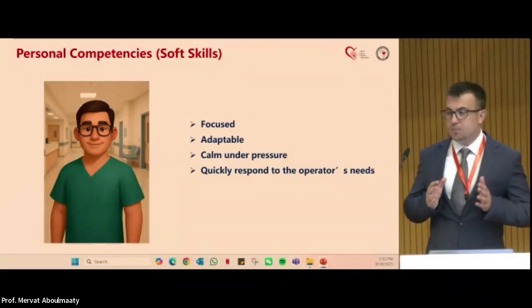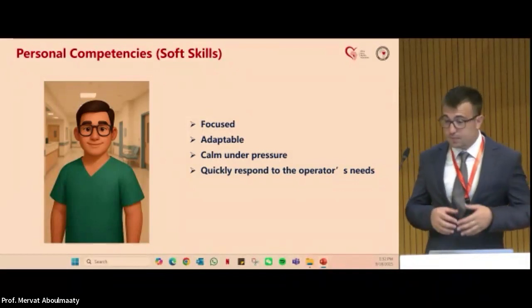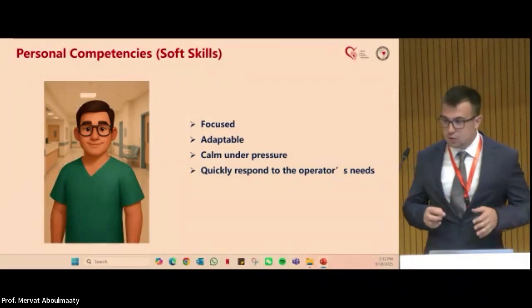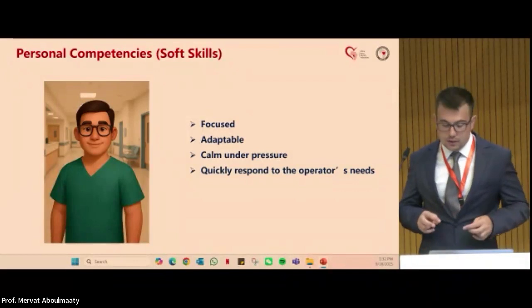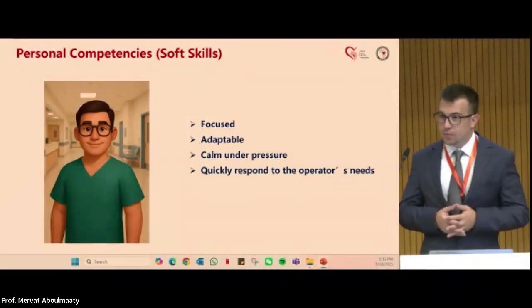And we need to be adaptable. During the case, the arrhythmia can change, or the tachycardia cycle length can change. We need to be adaptable, so we need to change our strategy. That's why we need to be focused, adaptable, and calm under pressure.